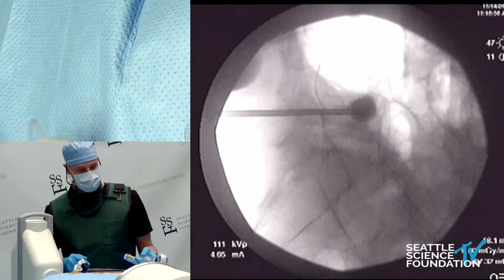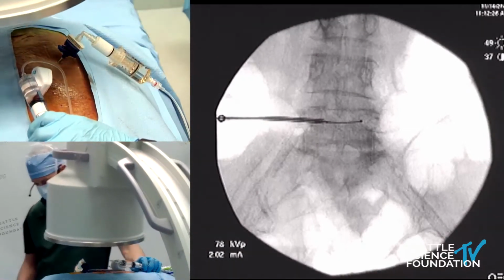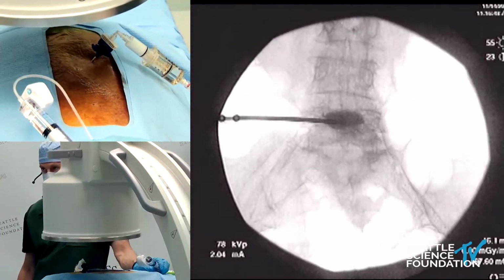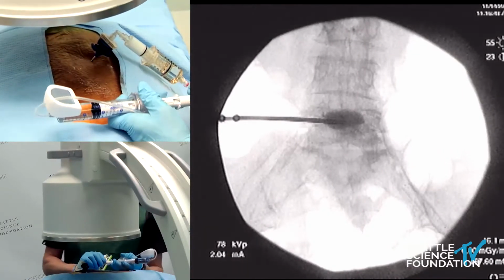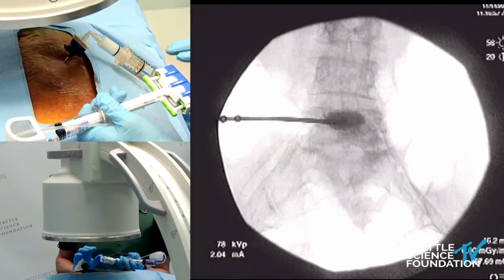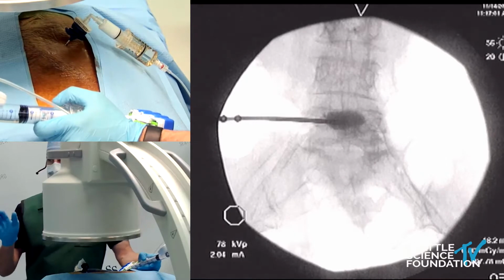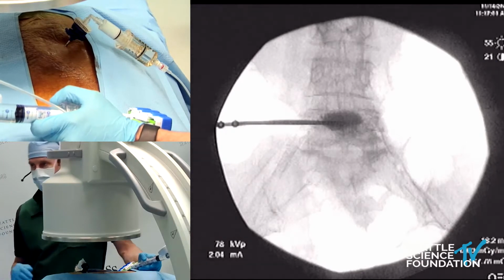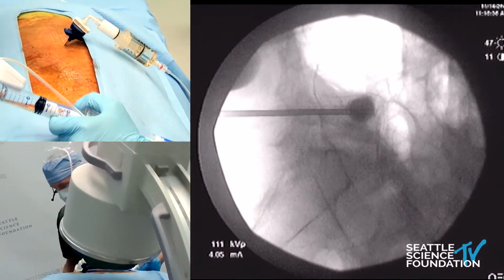And at this point, I'd like to take a look AP, see how we're doing. Cement fill pattern looks great on the lateral view. Looks great in the AP view too. So always encourage everyone to fill on the lateral view. Sometimes I will put a little bit of extra cement on the AP view to see where it tracks AP. And you can see on the AP view, we're getting in and around the interstices of the bone. So it's filled the cavity of the balloon, and now it's getting into the medullary portion of the bone. And that's exactly what we want to see. And we'll continue to fill.